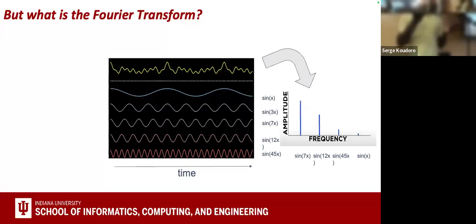To describe our domain with an image, we have the pixel intensity, the value of every pixel, and the pixel position. When you apply the FFT to that, you will have some textures, different elements that help you detect different elements in the image. This is how the FFT is used in image processing.